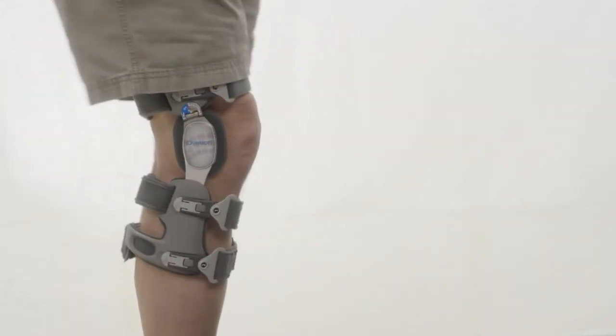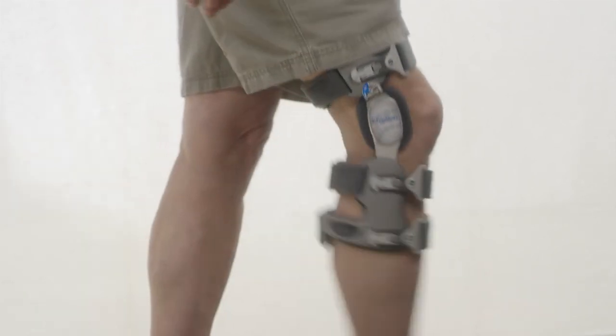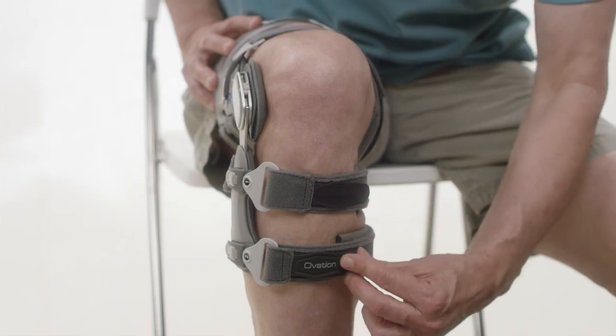Step 6: Brace comfort assessment. Once brace is applied, stand and walk a short distance to ensure comfort and proper correction. If there is any discomfort, adjust the straps as needed.